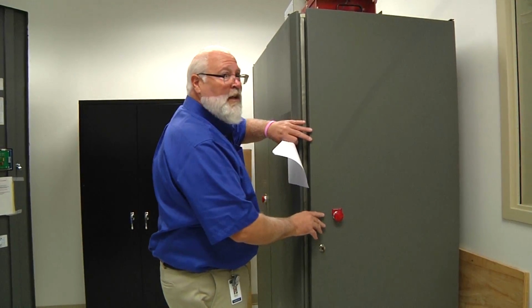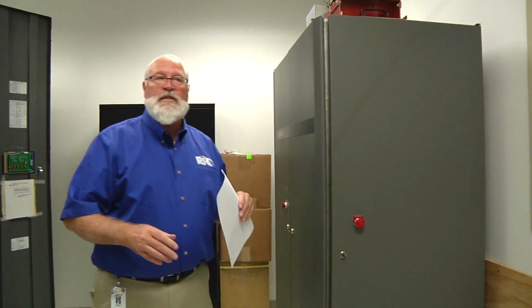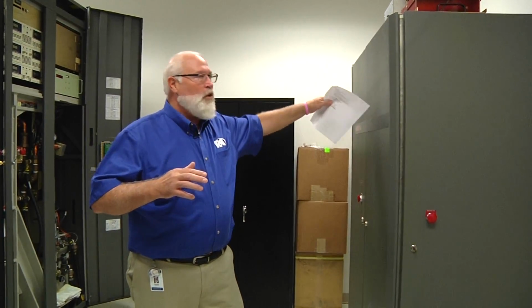And you heard the click. What that is, it's a crowbar in the system, and all these doors have an interlock switch on them. So when you open the door, it prevents any high voltage from being made.